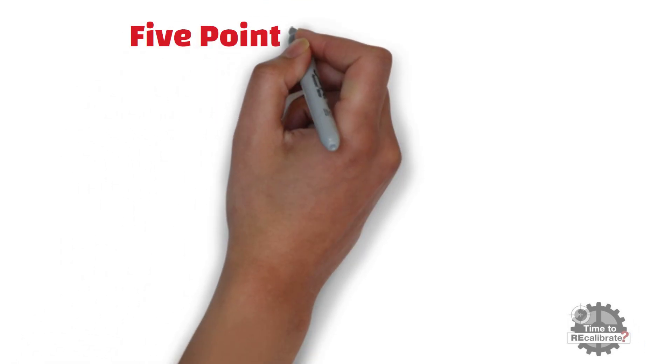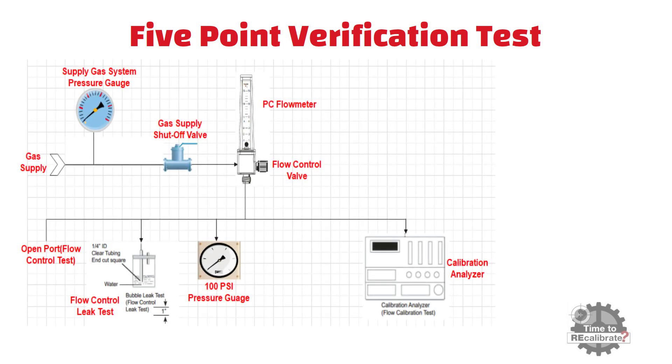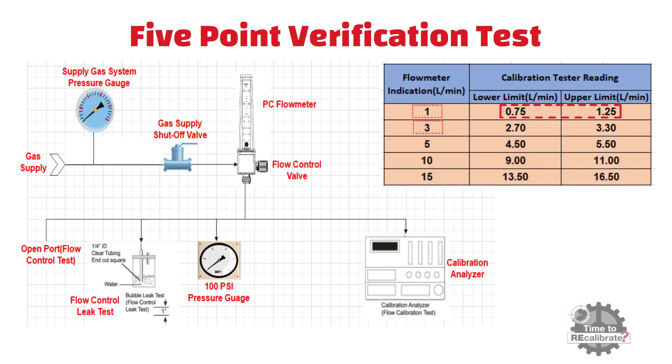Let's perform the 5-point verification or calibration test. First, set the flow rate of the oxygen flow meter to 1 liter per minute by rotating the flow control valve counterclockwise. At the same time, check the flow rate in the calibration analyzer — it should be between 0.75 and 1.25 liters per minute. After this, set the flow rate to 3 liters per minute and verify the flow rate in the calibration analyzer, which should be between 2.70 and 3.30 liters per minute.